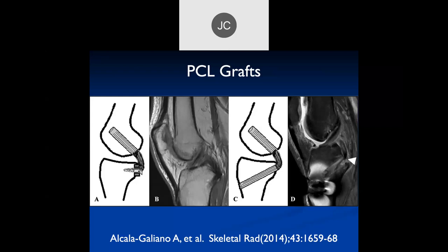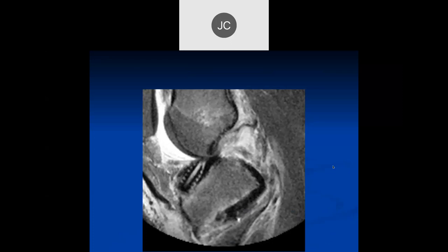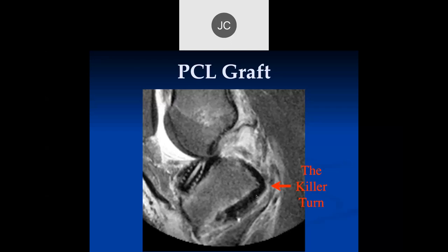As far as grafts, the two major ones are using a hardware construct to attach the graft to the posterior aspect of the tibia versus putting in suture anchors and tunnels on both sides. When you do these tunnels, the weak point of this procedure is right here - what's called the killer turn, where the posterior part of the bone can rub into the graft and produce a graft tear. This is what that killer turn looks like on MR. This patient had a knee dislocation with ACL and PCL tears, had grafts on both, and this shows the killer turn in the PCL graft, which is typically the weak point.